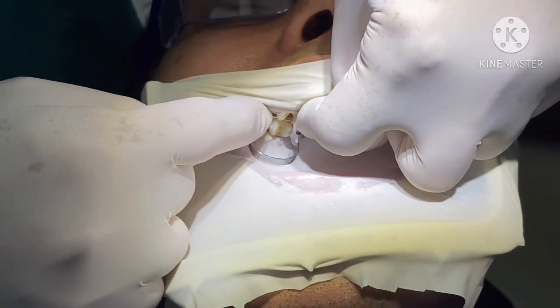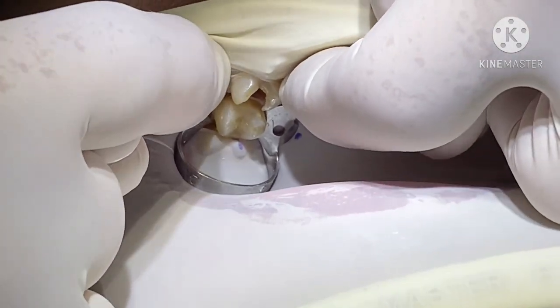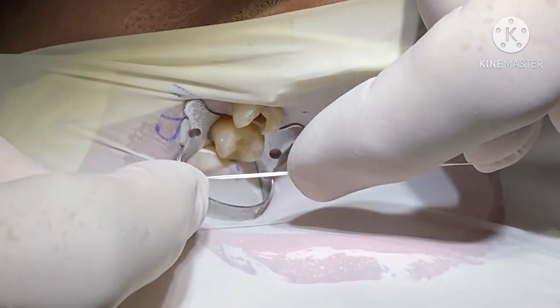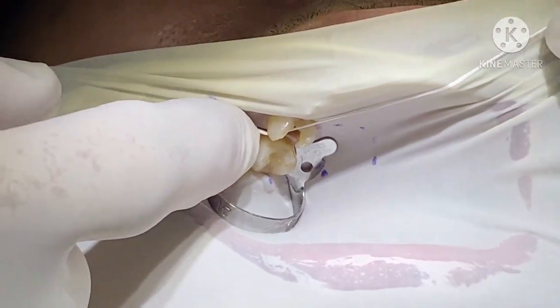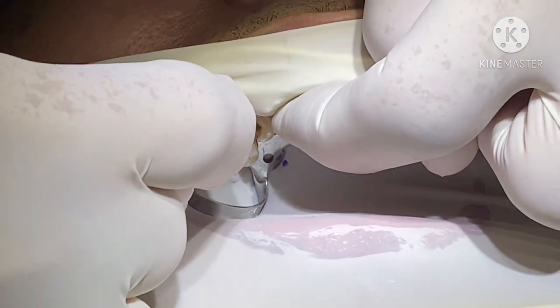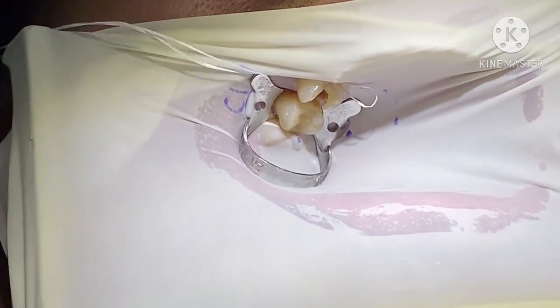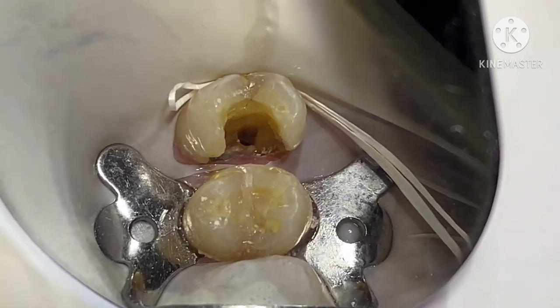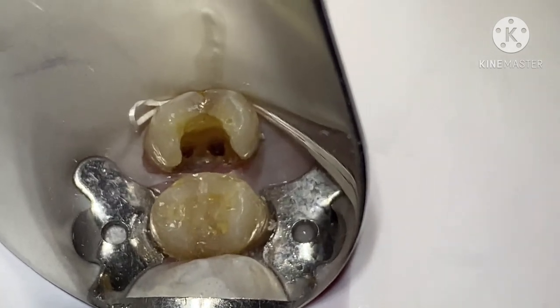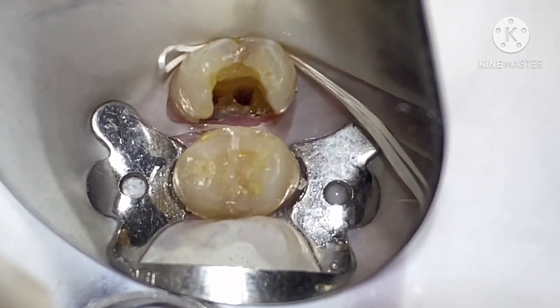Then we take the floss and take the stretch inside. Similarly, we take the rubber dam inside. We even can take once more. I do it again for you like this. Like this, and push like this, and it's all set. Now with this method, you can observe that there is no stretch of rubber dam on the step portion and the whole tooth is visible.